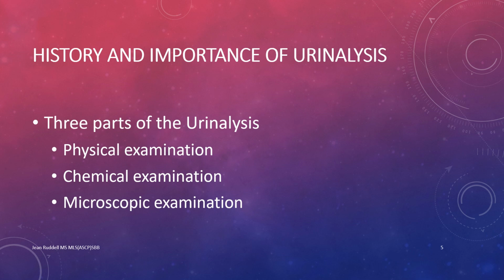History and importance of urinalysis. The 3 parts of urinalysis are physical, chemical, and microscopic examination. Throughout history, we can tell by the documentation in images, drawings, and records that physicians or healers made observations of urine to determine the cause of a person's health issues.